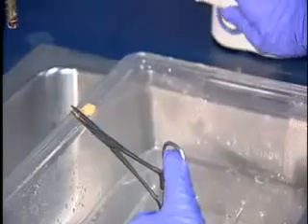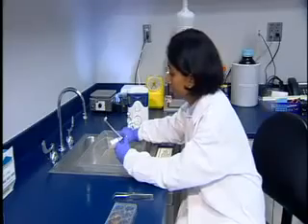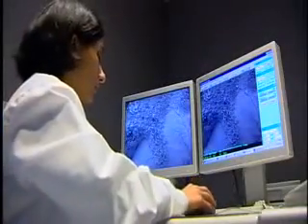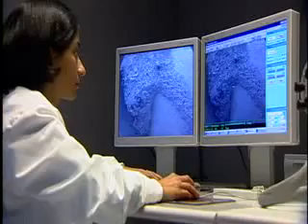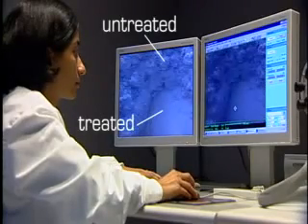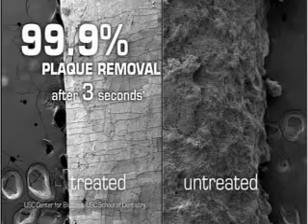This was subjected to a three-second Waterpik Jet treatment where we used both the standard tip and the orthodontic tip, and the teeth were prepared for scanning electron microscopy and later visualized by imaging. The results were almost impossible for me to believe the first time through, so we've stacked the deck very heavily against Waterpik. We had built a four-day plaque on top of an old, calcified plaque. When we looked at the tooth under the scanning electron microscope, we saw huge areas of biofilm removal on the teeth treated with the Waterpik compared to those which were not treated — virtually total removal of the plaque. We saw a 99.9% reduction of biofilm in the Waterpik-treated tooth.